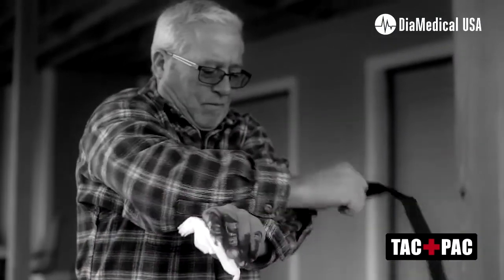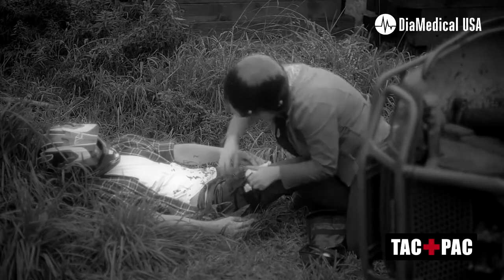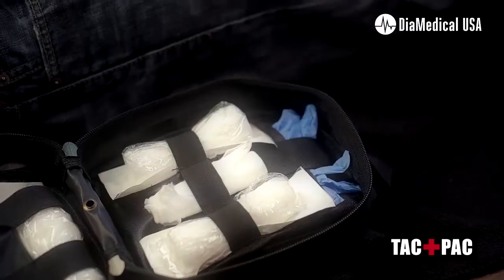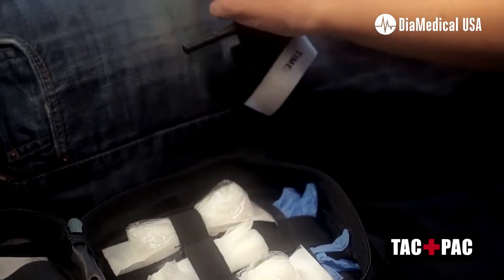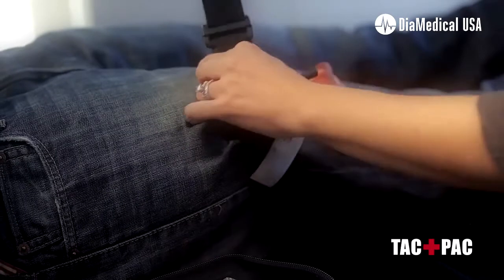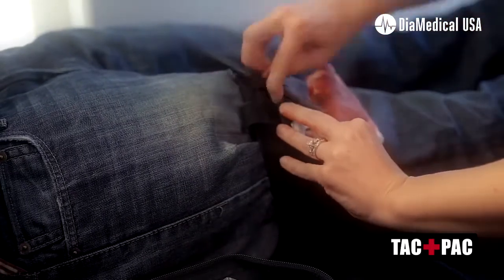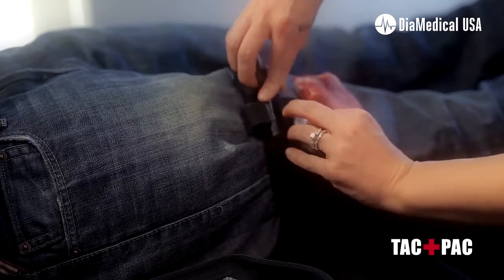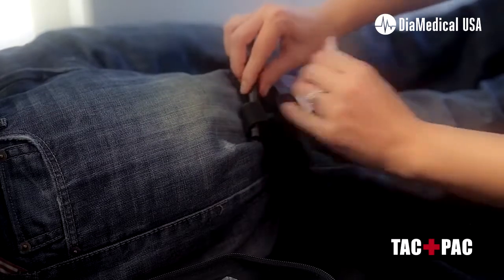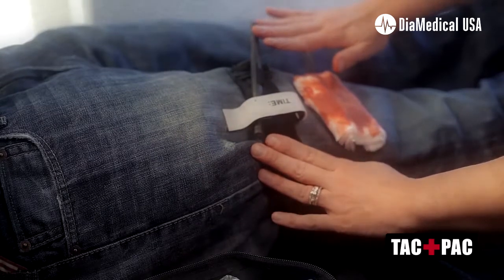A tourniquet should only be placed on the arms or legs, and it should always be placed above the wound. For an injury to the leg, you slide the tourniquet above the wound, pull on the red tab, tighten it down snugly, turn the windlass, lock it into place, and cover. When the windlass is locked into place, all bleeding should have stopped.